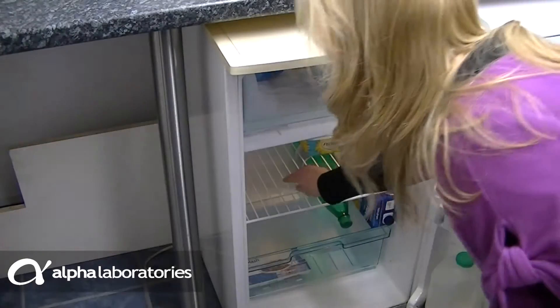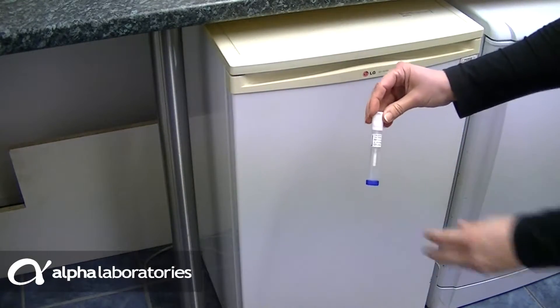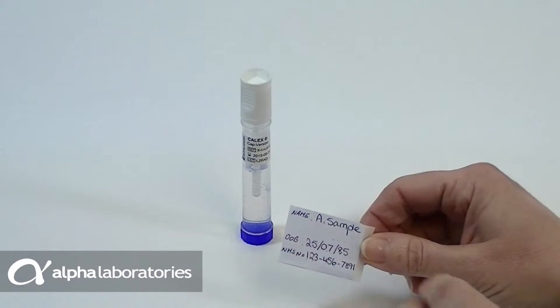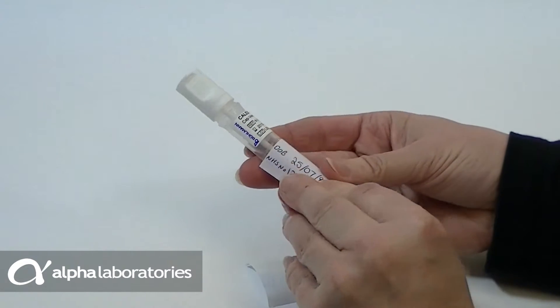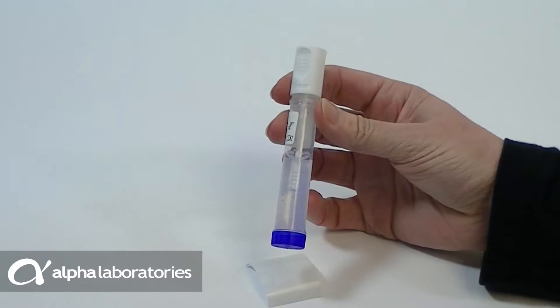The Calix Cap device has been provided so that a Calprotectin test can be performed on your stool sample. Ensure the Calix Cap device is stored in the fridge until you are ready to use it. On the label provided by your doctor, write your name, date of birth and NHS reference number. Attach the label to the Calix, ensuring it does not obscure a view of the plastic pin within the tube. This is important in the laboratory processing of the test.